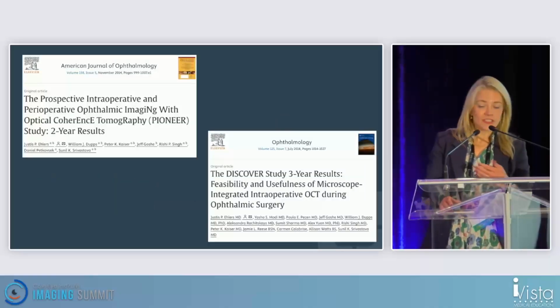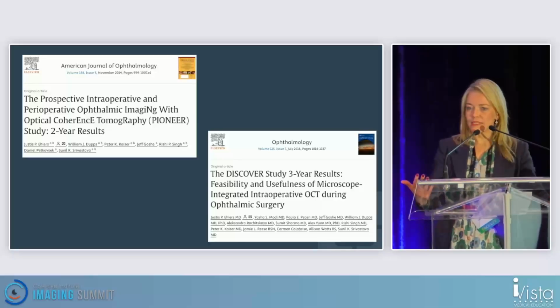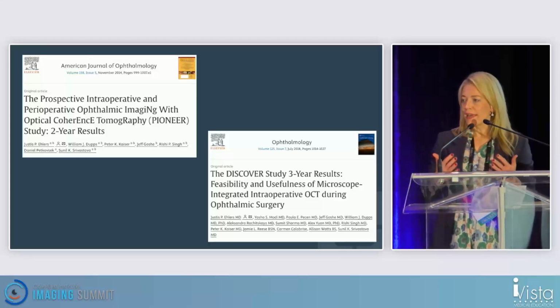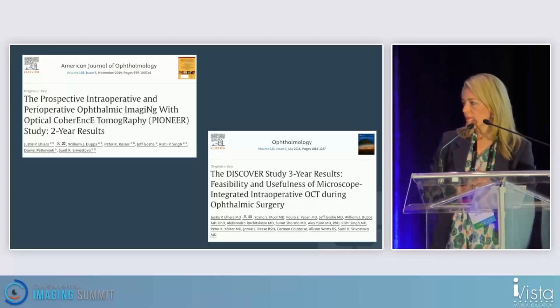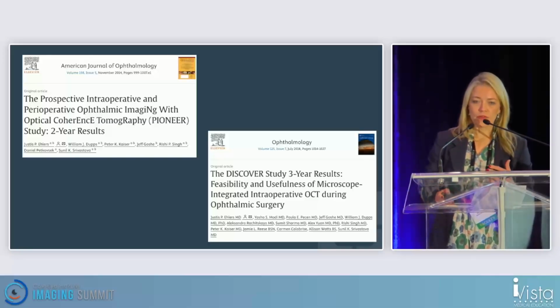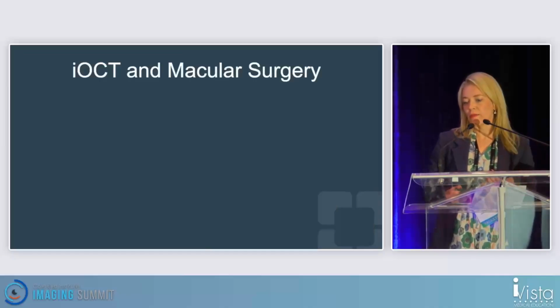So Justis and many others have looked at intraoperative OCT and have really studied what the potential benefits are. But it always comes to: does it really help me when I take care of my patients in surgery? And I think when we think about intraoperative OCT, most people think that it's most useful for macular pathology.